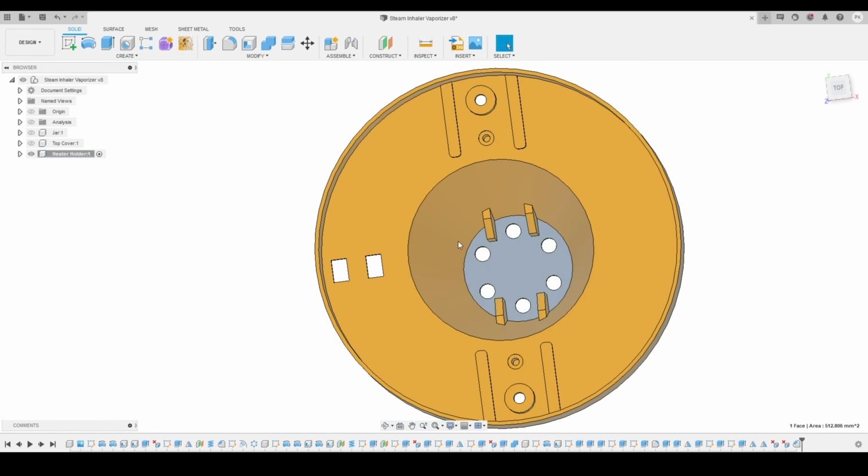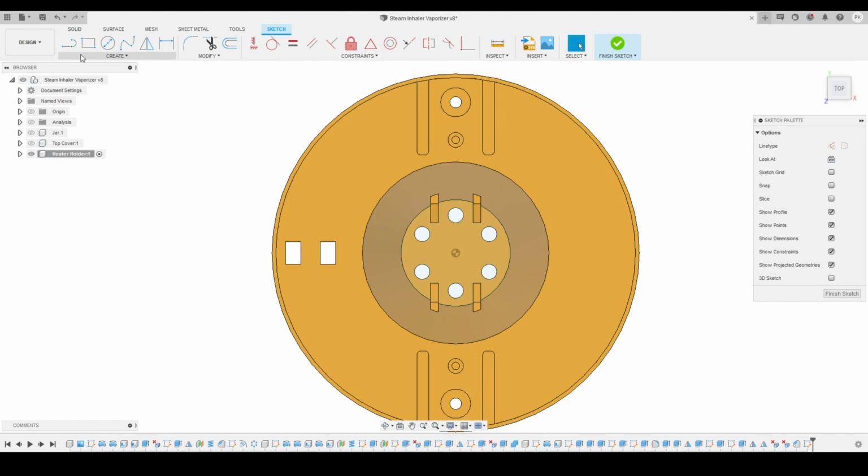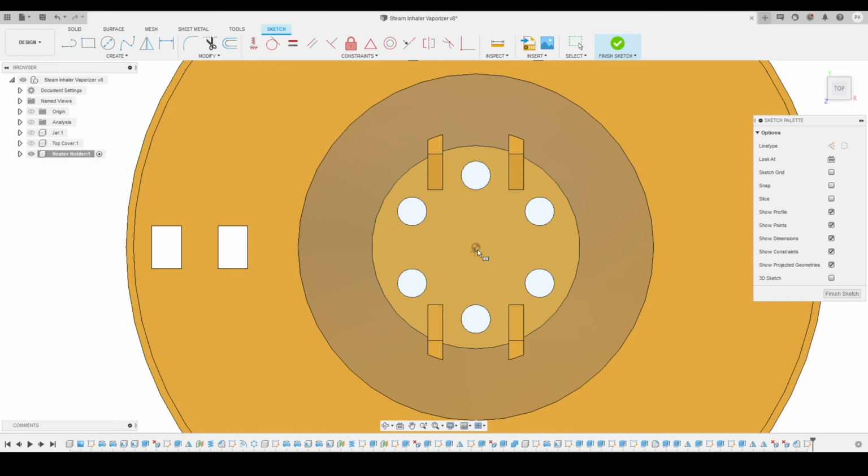So we'll select the face of this heater holder and click on create sketch, and here we forgot to add one feature. So we'll go into the create panel over here, and then we'll go into rectangle. I will activate the center rectangle tool, and we'll create a rectangle like this. Now I will define the size of this rectangle. So this one is 2 millimeters, and this one I just want to keep 13 millimeters. I think that will work. So we'll change that to 13 millimeters because 13 is the best distance.